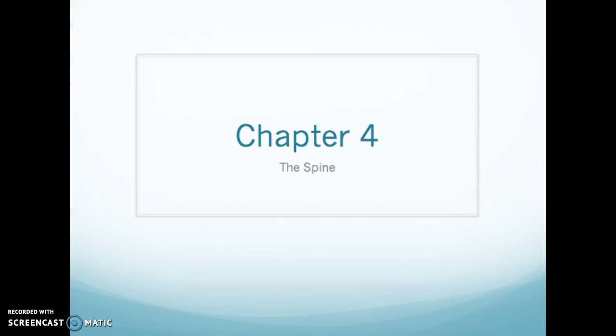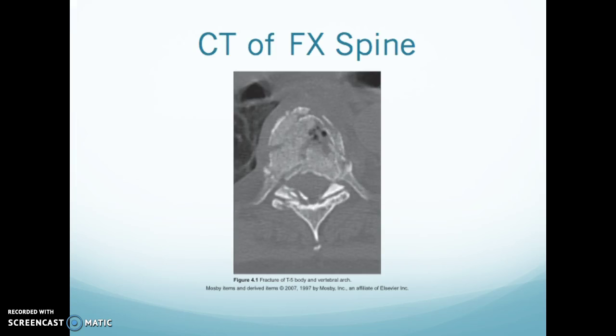We are already on chapter 4, which is the spine. When we are looking at the spine, CT is really good for any kind of gross bony abnormalities, such as compression fractures. This is a great example of a compression fracture of the T-spine. I know that because I can see the rib coming off, and there's also lung visible here, so that gives me the clue that we are in the thoracic cavity.